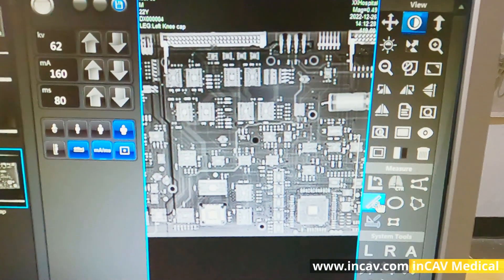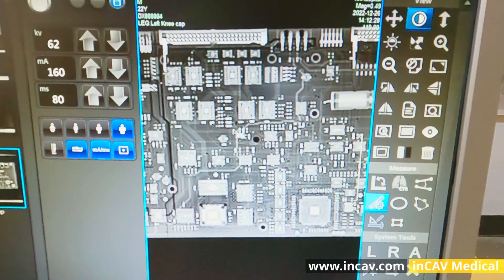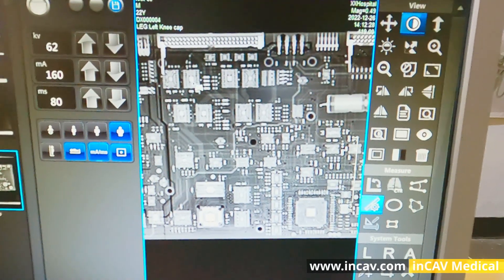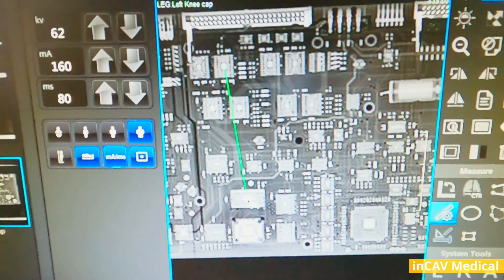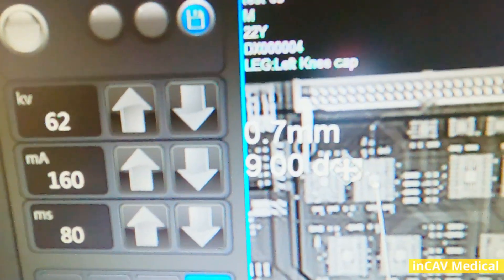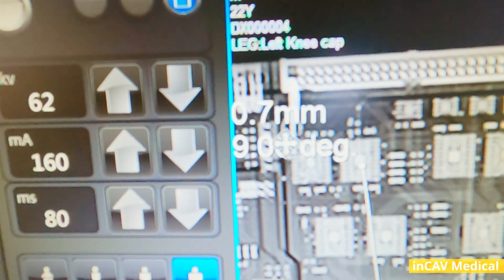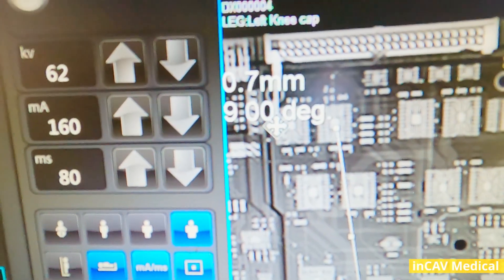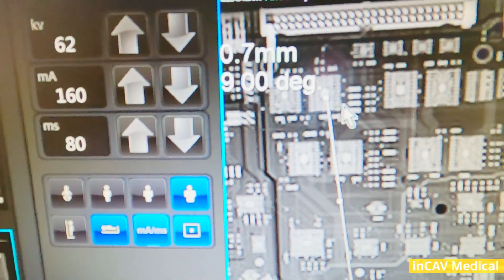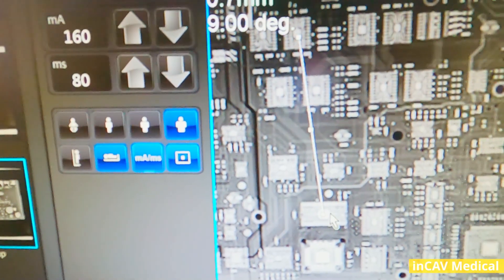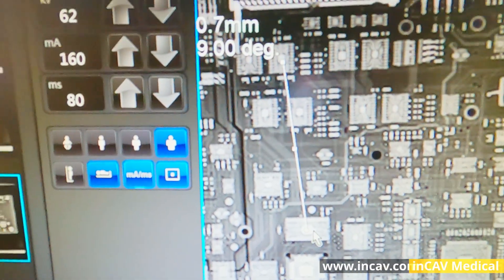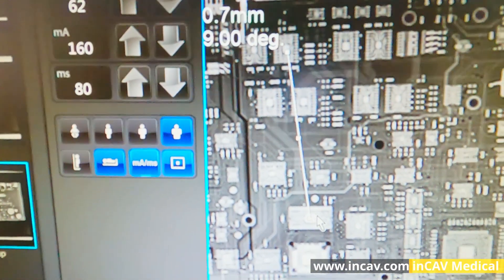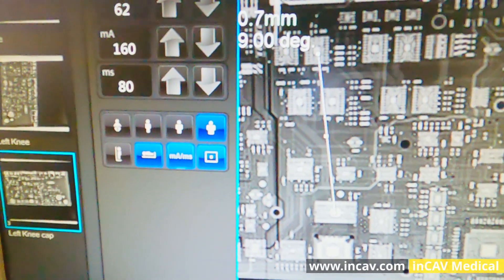We also have measure tools. We can measure distance and angles, very easy. Just click from one point to another point and we will get the dimensions, the distance. We can also measure square areas, polygons, ellipse, and more.